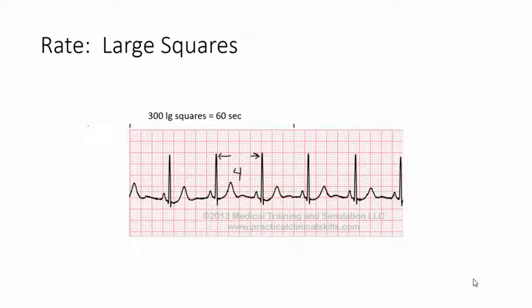Okay, now to get the heart rate using this method you take 300 and divide it by the number of large squares between each R wave. Okay, and that'll give you the heart rate. So ours, we take 300 divided by 4. The heart rate here is 75 beats per minute.